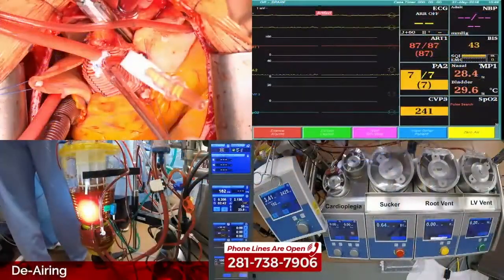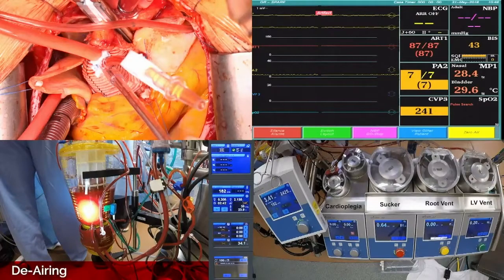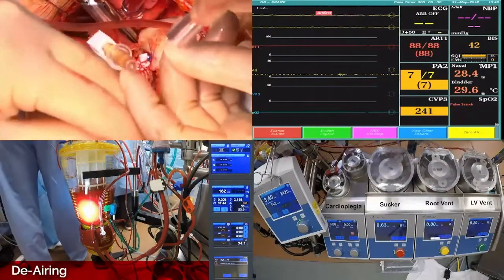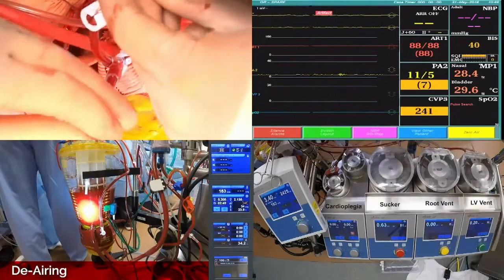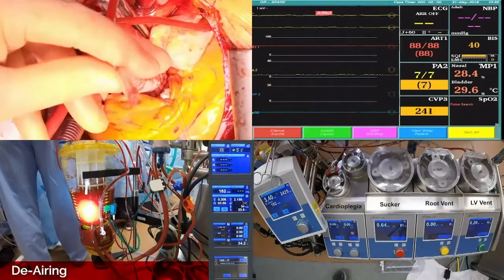Let's continue with Patrick. So we're going to pick this surgery up where the cross clamp is about to come off for the first time on this case. And this is Dr. Mettauer's own personal way that he came up with on how to de-air. So that's at 1 hour, 46 minutes. If you can roll, we can kind of talk about how we do this. It involves antegrade and retrograde and all kinds of fun stuff. That's my own thing, but it does serve a purpose.